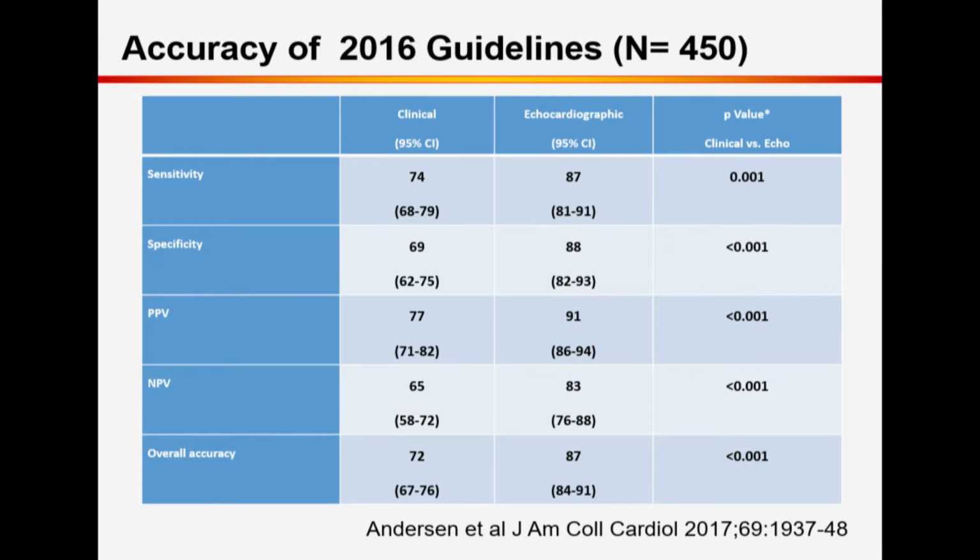Since their publication, there have been several studies looking at the accuracy. I'm using a study that we were the core lab for. Here included 450 patients. Accuracy very decent compared to clinical accuracy, and here clinical was judged by clinical exam as well as chest x-ray and natriuretic peptides as evaluated by cardiologists, not internists.